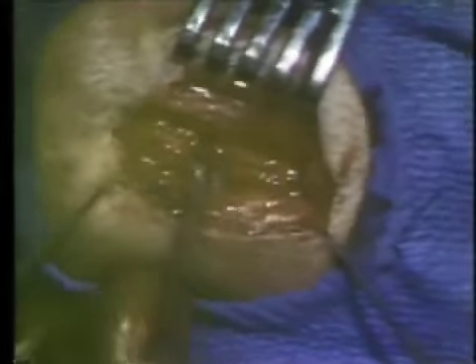The bone block will be eliminated and nerve preserved and temporary holes placed before proceeding intraorally with the adjustment of the entire anterior fragment, relating it to the functional occlusion that is the goal of the operation.